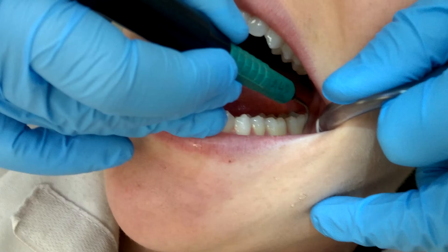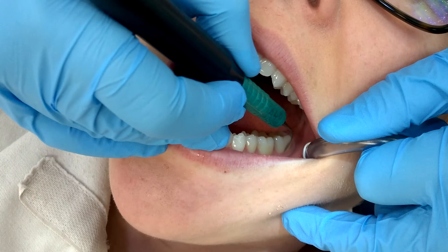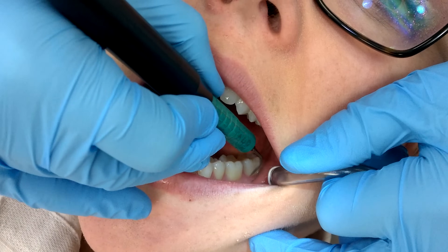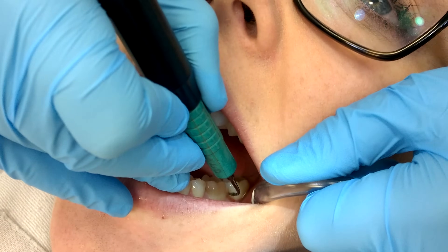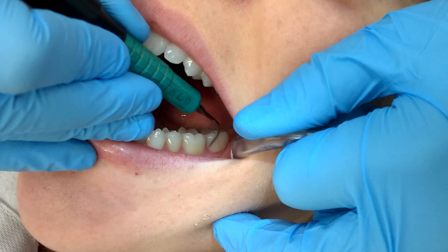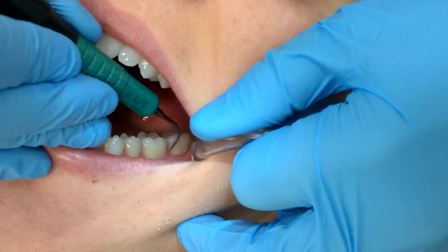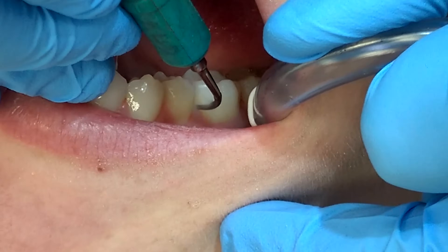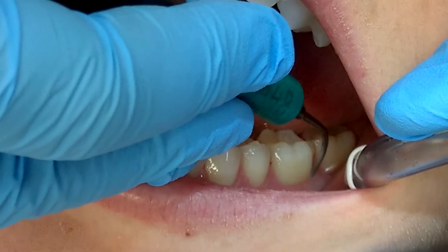I'm now going to change clock positions to sit at about 11 o'clock to do all of my posterior surfaces. One of the main points I want to make here is that scaling with a sequence will make you more efficient. If you're scaling by arch — all the way from 1 to 16 on the buccal and back from 16 to 1 on the lingual — you're wasting time and moving your clock positions and suction a lot, which is also harder on your body. Get a sequence and stick to it.